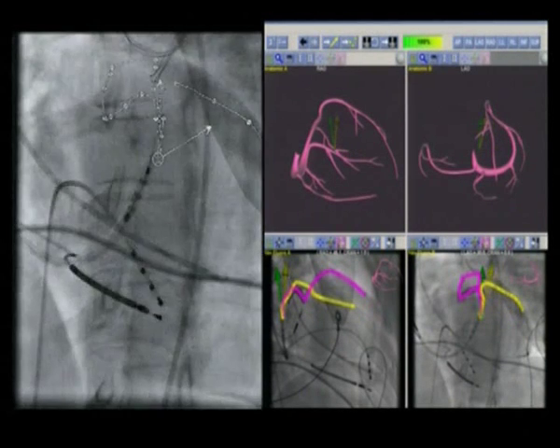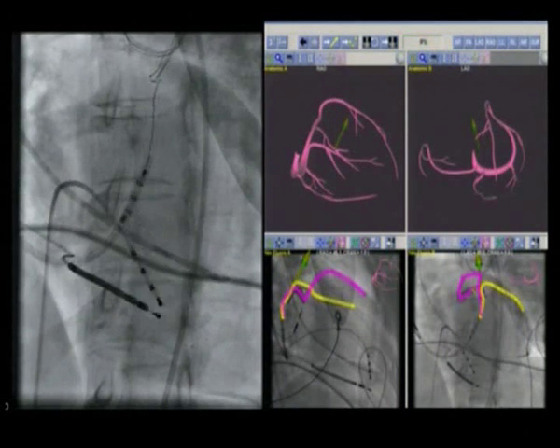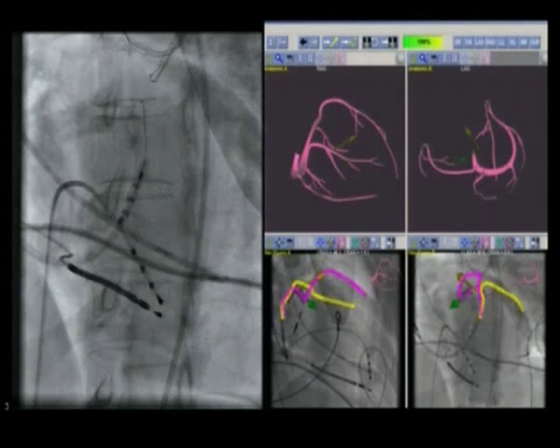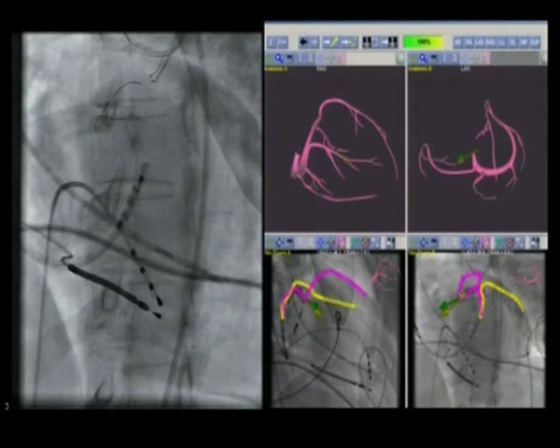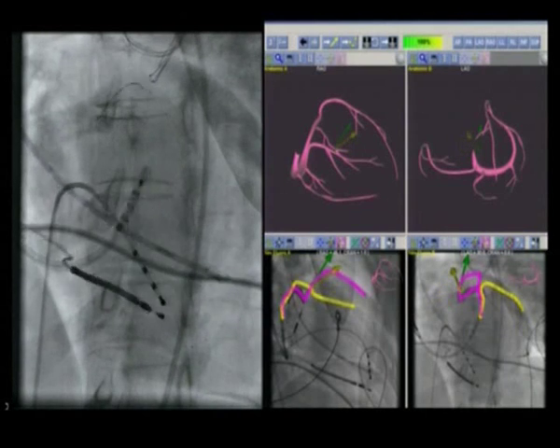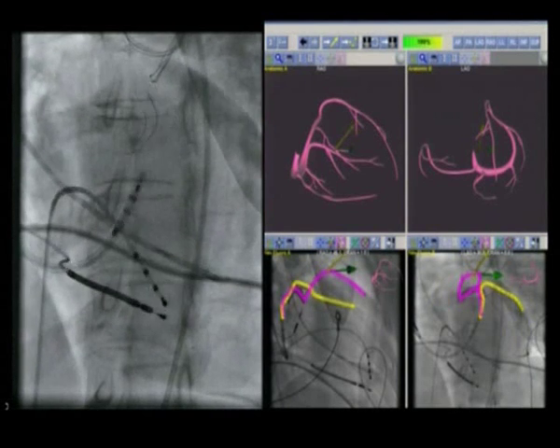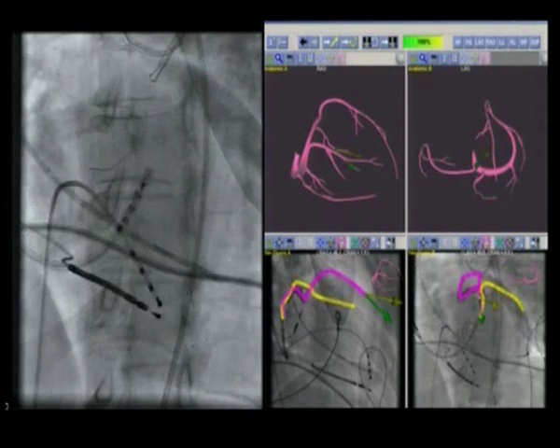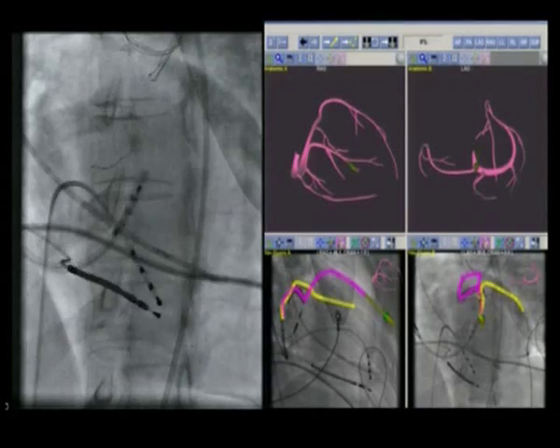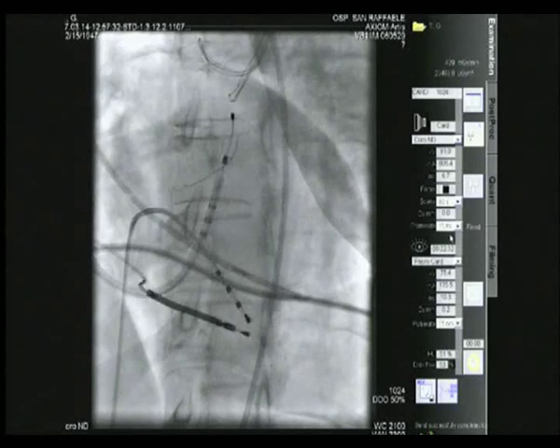After assessing the lateral branch, we will place the magnetic guide wire in the anterior branch. On the top right panel of the screen you can see the schematic representations of the coronary sinus and its branches in the right anterior and left anterior oblique views. On the bottom, the respective fluoroscopic images from the same projections are shown, with the vessel roadmap showing the lateral branch in yellow and the anterior branch in pink. In all four panels you can see the vector arrows represented in green and yellow. The green arrow represents the desired direction the guide wire tip needs to take, whereas the yellow arrow is the direction of the magnetic field. As the yellow arrow moves toward the green one, the magnetic field is constantly applied to steer the magnetic guide wire toward its final direction.